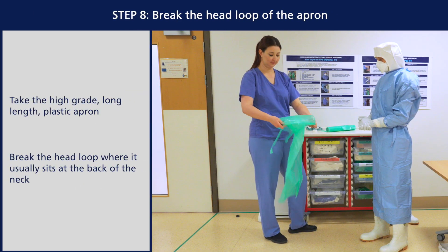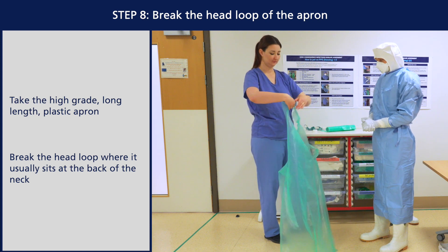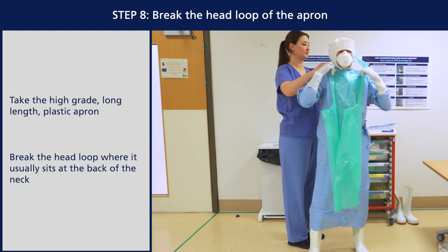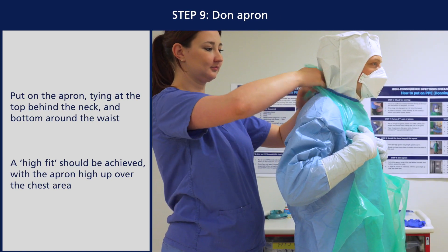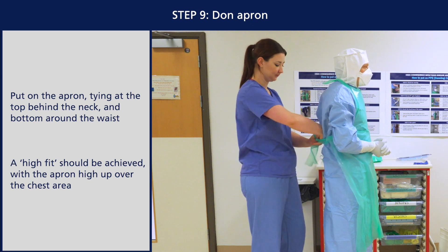Take the high grade long length plastic apron and break the head loop where it usually sits at the back of the neck. Put on the apron, tying at the top behind the neck and bottom around the waist. A high fit should be achieved with the apron high up over the chest area.